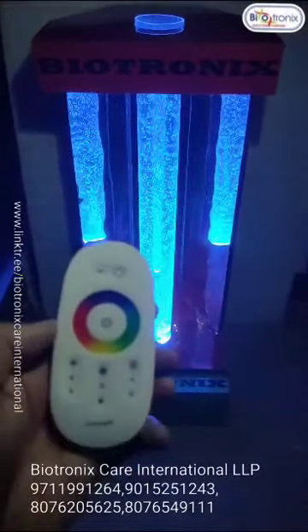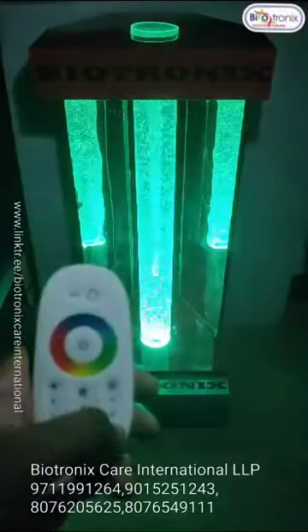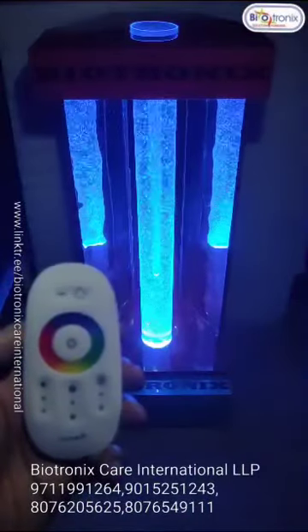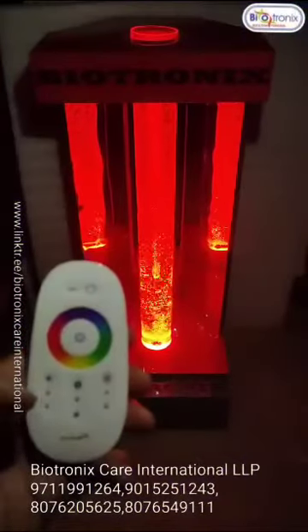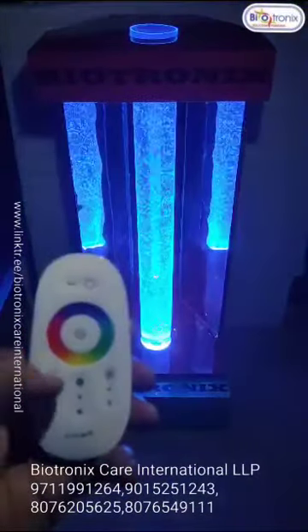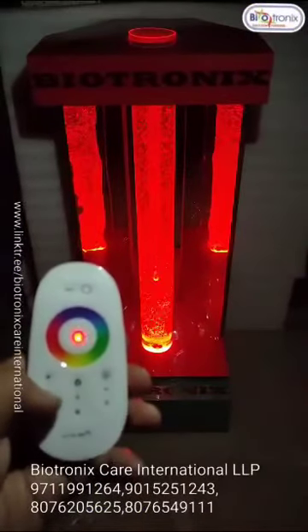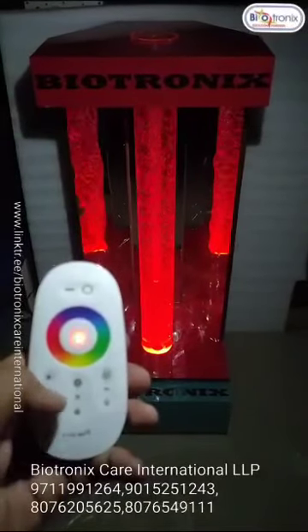And you can select 20 modes — different types of light blue modes. You can adjust the brightness also, you can reduce it.